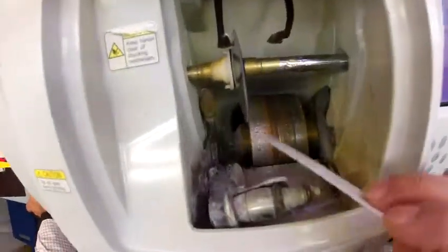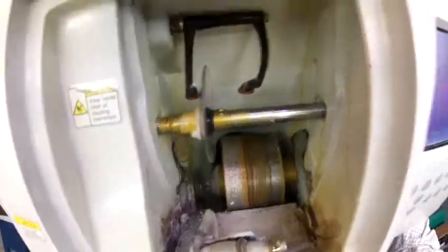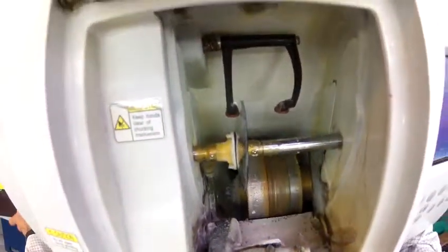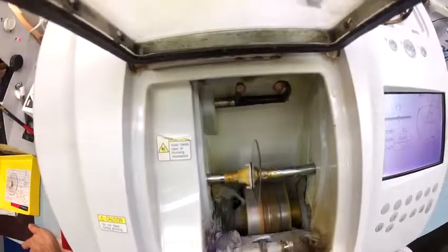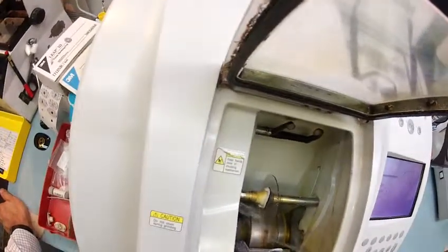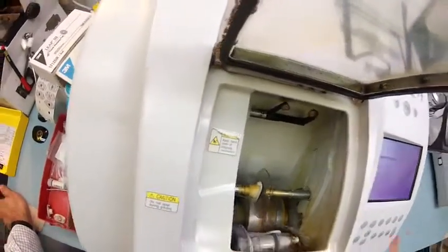The cutting wheel is actually down here at the bottom. It's that lighter color wheel on the left. It's like a heavy grit sandpaper, and that's going to grind away your lens material. And this wheel in the center with that channel, that little valley, that's what's going to put the bevel onto the lens, so it stays inside the bevel of the frame. I will have to close the door in a moment just due to the sound, but for now I just want you to see as your bifocal transitions touches down on the cutting wheel.